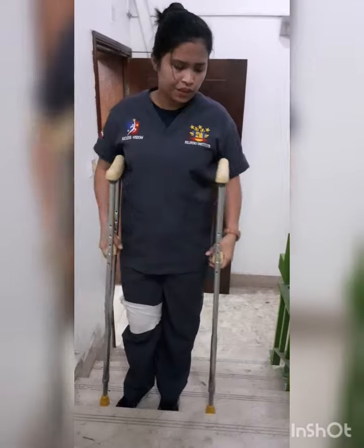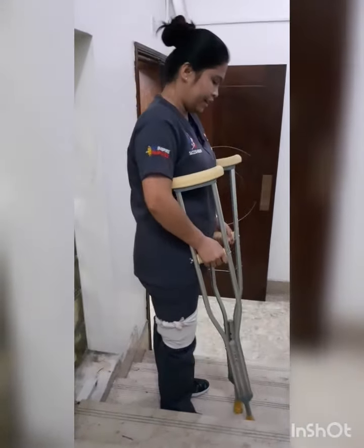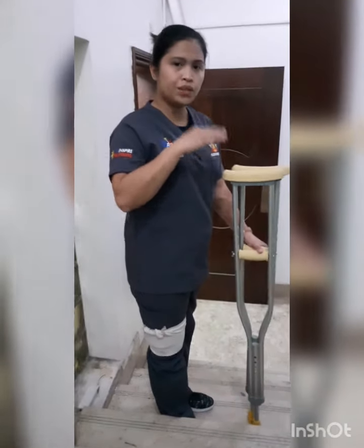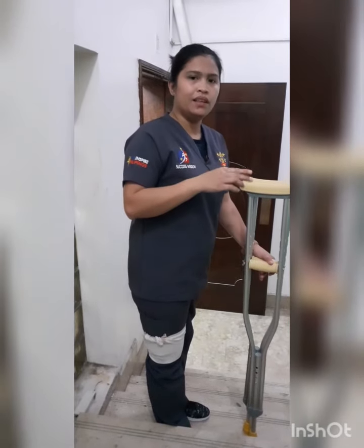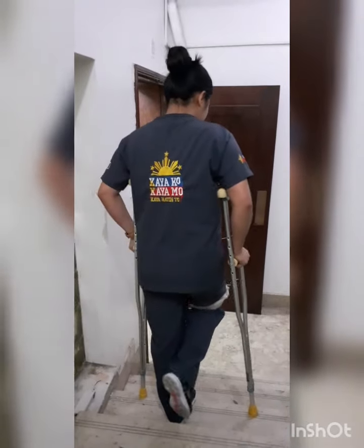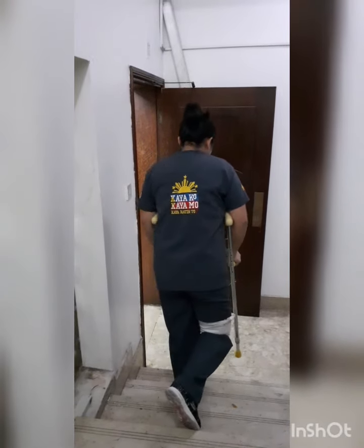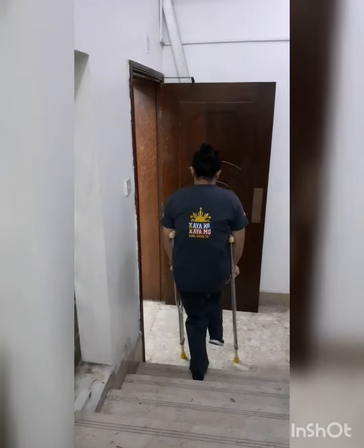And how to go down — this is also how to use it for going down. Always remember: if going up, it's the good leg first; and if going down, it's the bad leg. Always bad leg if going down. So this is my bad leg: down, down, down, down.